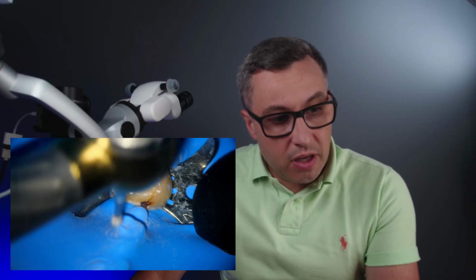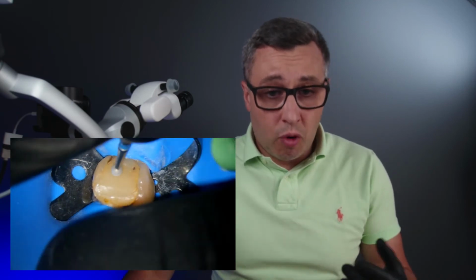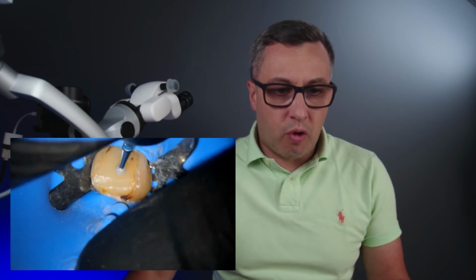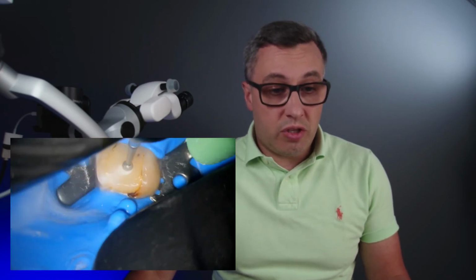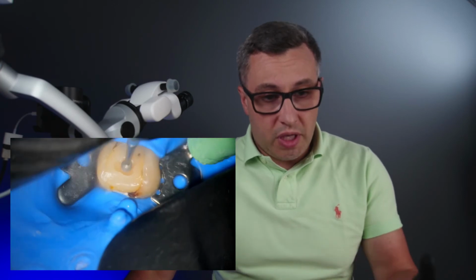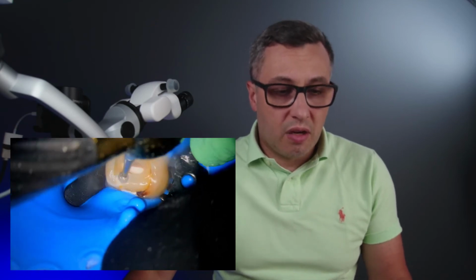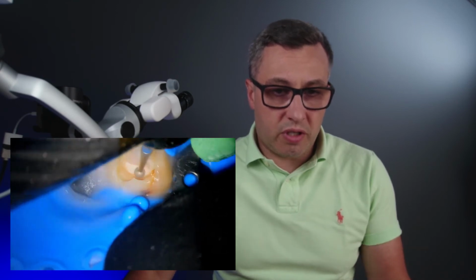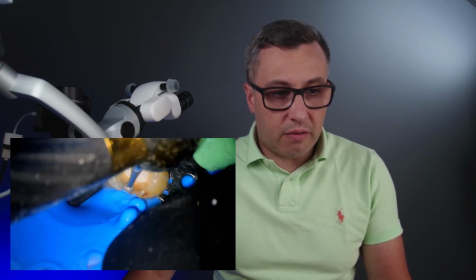But let me show you how it works with a patient in the mouth. The video that you are seeing right now is the video that we recorded not with this adapter, but with a normal camera. And that was a very good format, because this is ProRes. ProRes, if somebody doesn't know, is the format which is used for professional videography. And of course, it's color graded, so the colors and everything are prepared. That is why you can see a lot of sharpness and a lot of fruitiness of the color. So with a good quality camera, you can reach this kind of level.